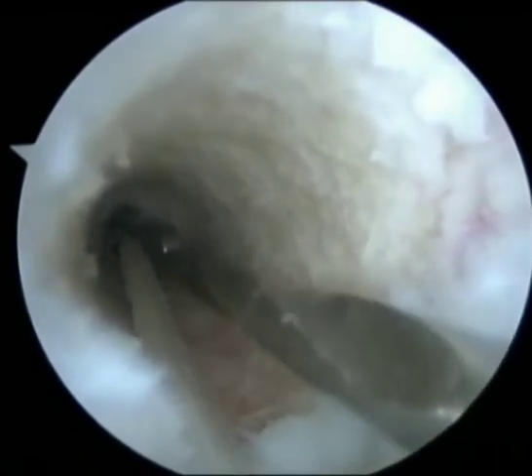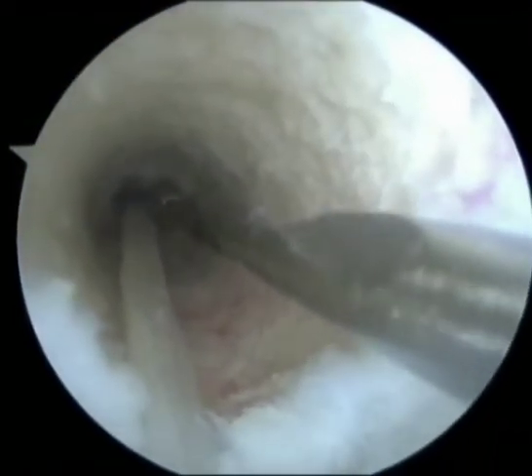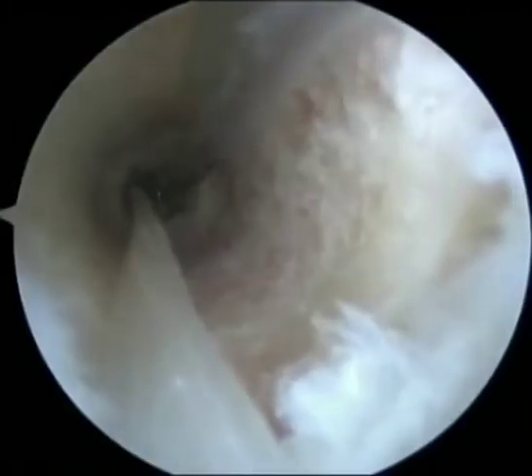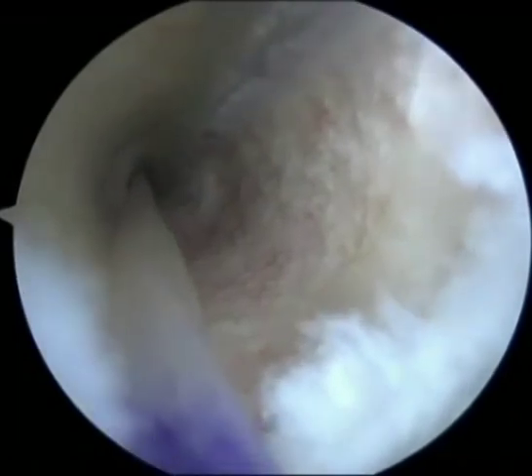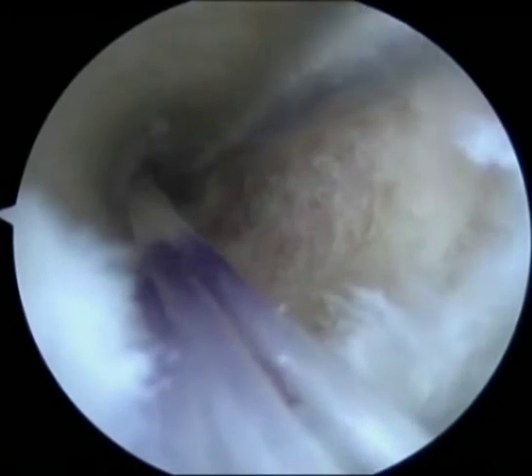The button is then pushed slowly through the pin hole by gently tapping on the guide pin by the assistant, while the surgeon stabilizes the guide pin. As soon as the button passes beyond the lateral cortex, the push from the guide pin causes it to flip on the cortex with a feel of loss of resistance.